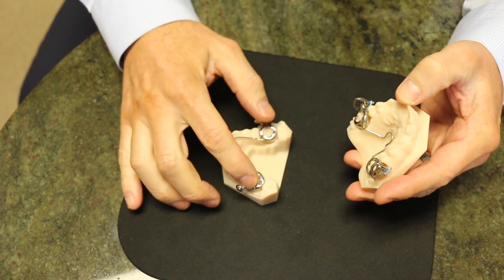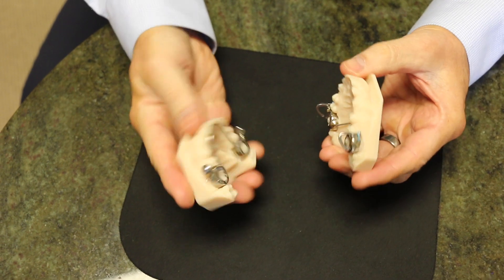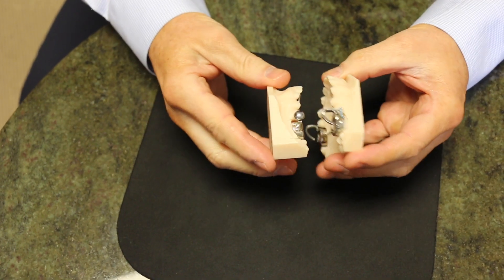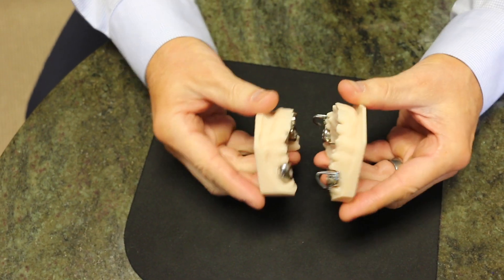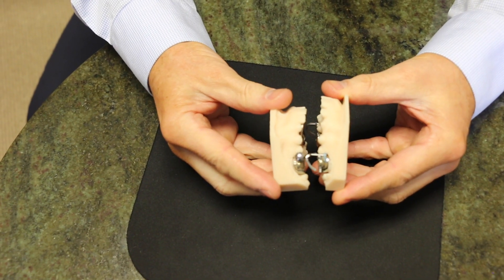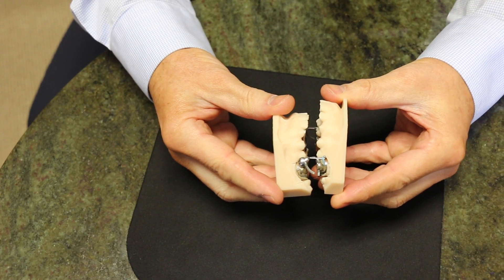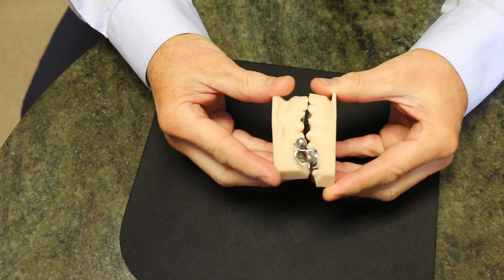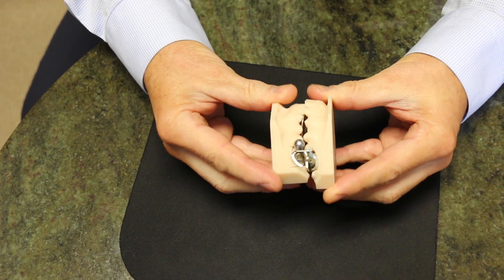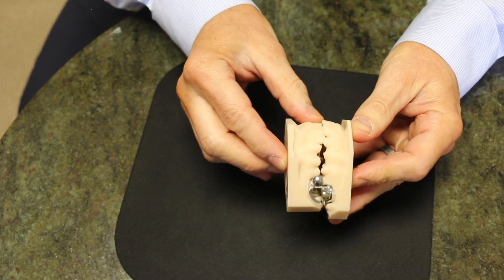Of course we glue this in place around these teeth and now with this MARA appliance glued in place, remember the patient used to bite so that their upper teeth were quite a bit ahead of their bottom teeth. Well now when they bite these metal parts interfere with each other so they can't bite in their normal bite without sliding their jaw forward into this position. Now look at the positioning of the front teeth. Much better.